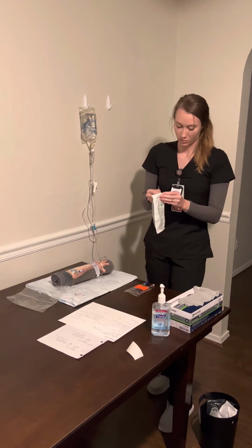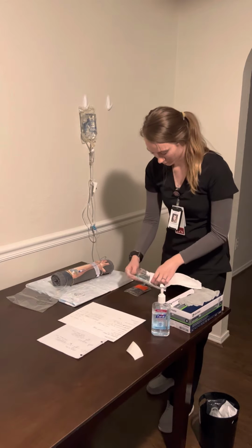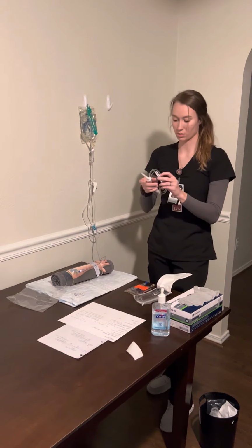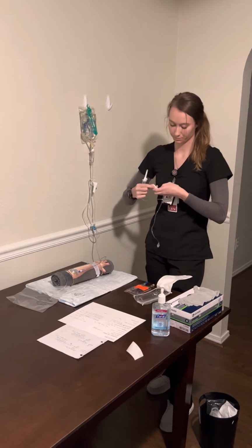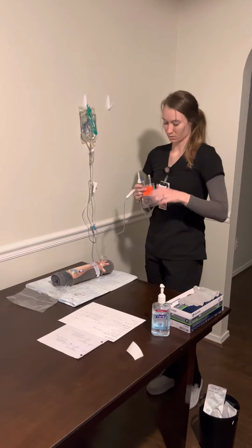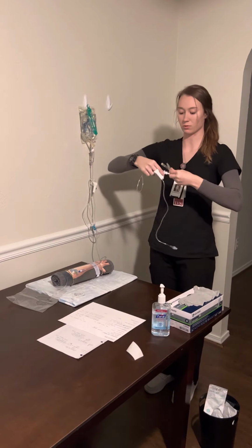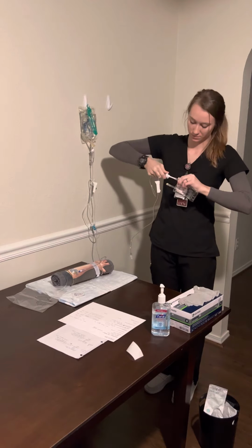So I'm going to grab my tubing. Make sure that my roller clamp is closed. Okay, and then same thing here, I'm going to remove that cap, ensuring not to touch that port, and then remove the cap from the tubing and spike the bag.